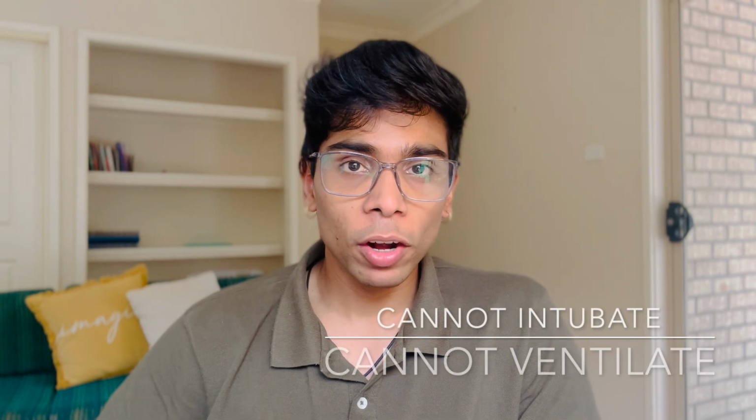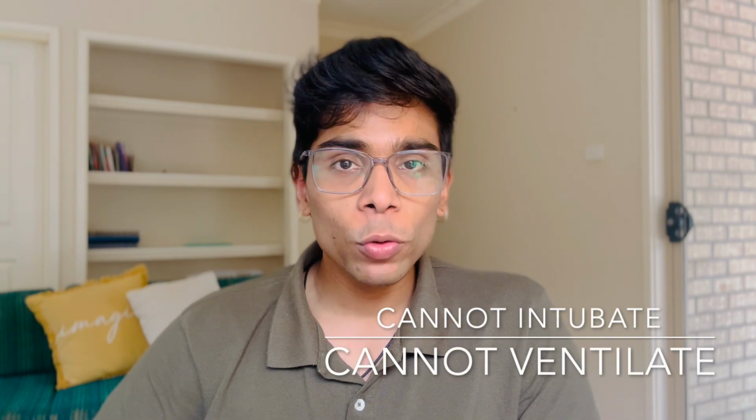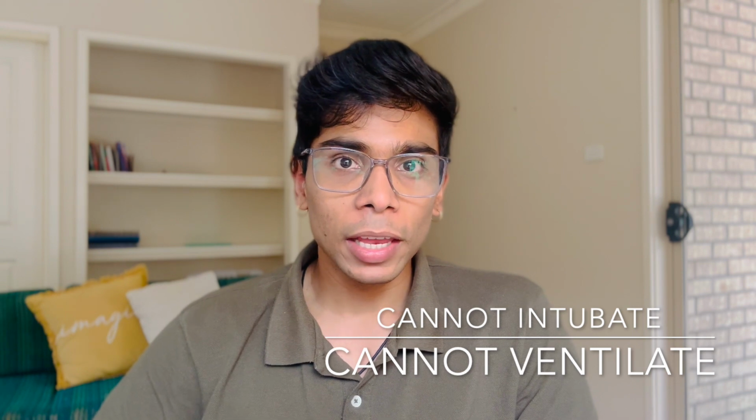Welcome everyone. Today we are delving into a critical emergency procedure, the cricothyrotomy, or the emergency front of neck access. In high-stakes situations where traditional airway management fails and you end up with a cannot intubate, cannot ventilate situation, knowing how to safely perform a cricothyrotomy can often mean the difference between life and death for your patients.